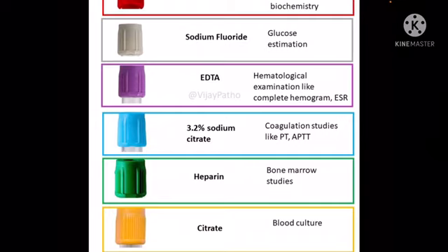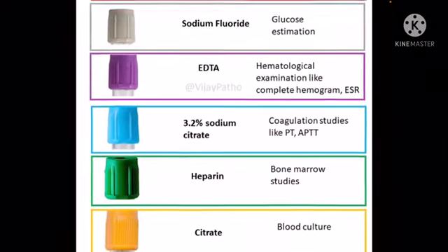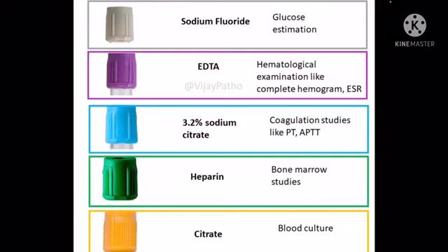The next is the purple cap Vacutainer, also called the EDTA Vacutainer because the anticoagulant present in it is EDTA. The purpose of this Vacutainer in the laboratory is hematological examinations like complete hemogram, ESR, and other studies.